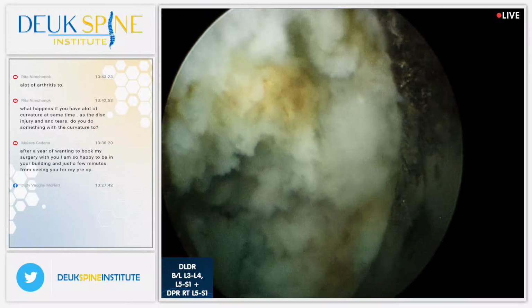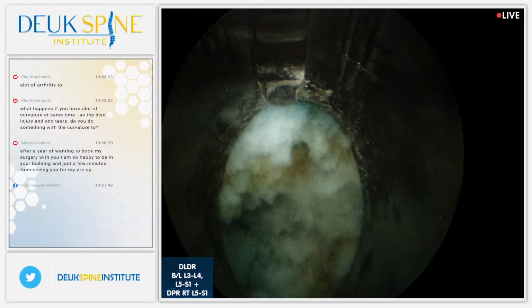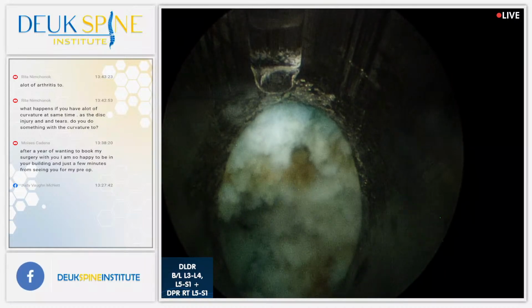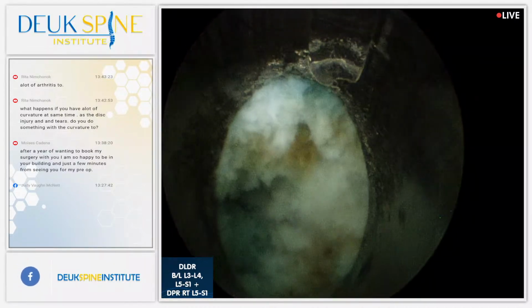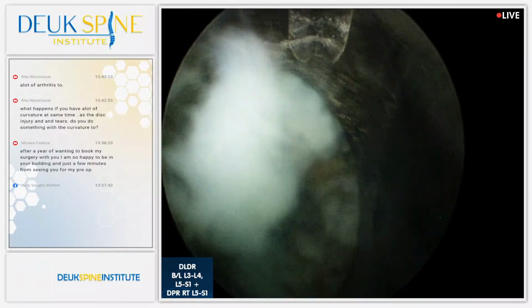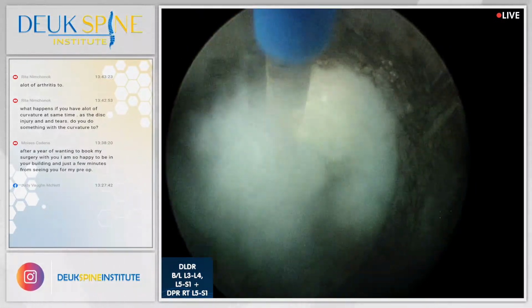All right, see all the blast marks there on the metal? Every one of those areas is the laser energy hitting it and melting it. So you could tell we've had this tube used for a while. But this is the tear that we're cleaning. This is where the inflammation happens.